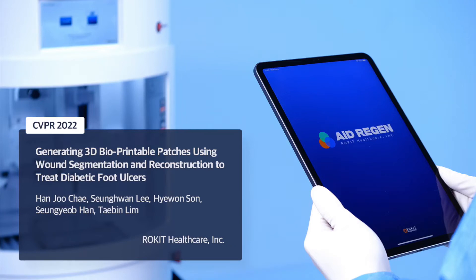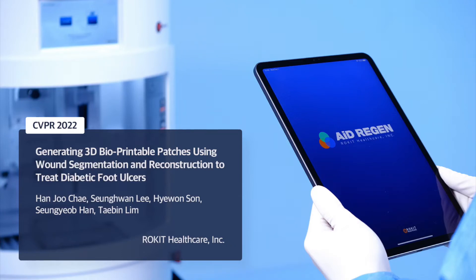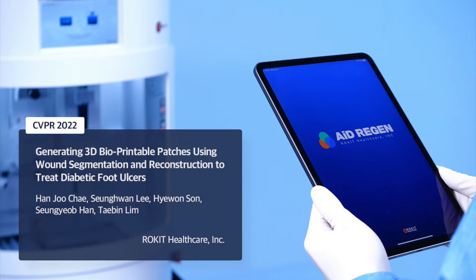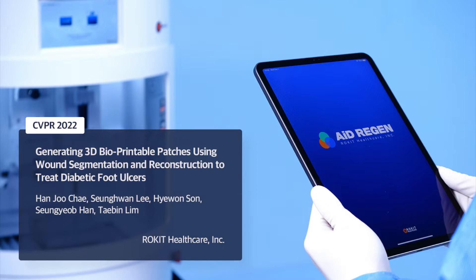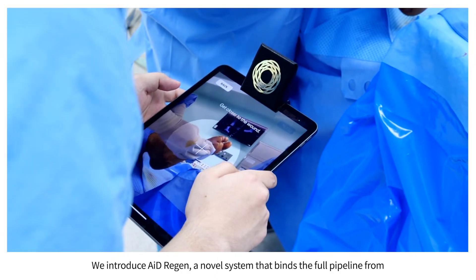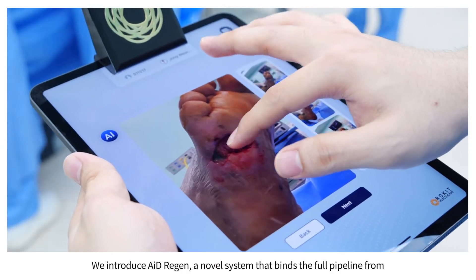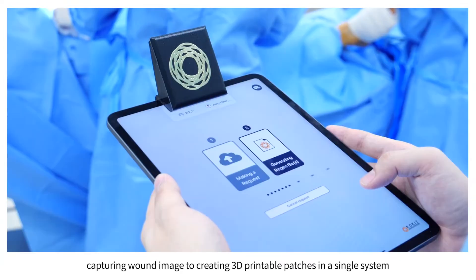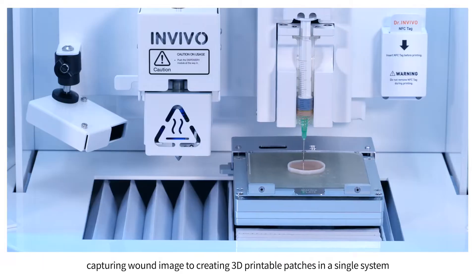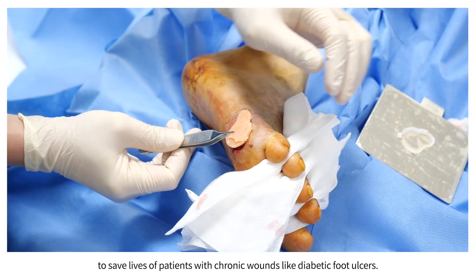We introduce AID Regen, a novel system that binds the full pipeline from capturing wound image to creating 3D printable patches in a single system to save lives of patients with chronic wounds like diabetic foot ulcers.